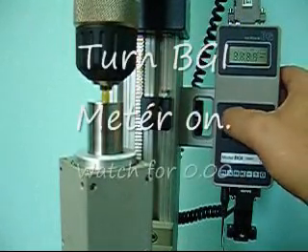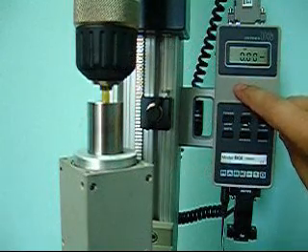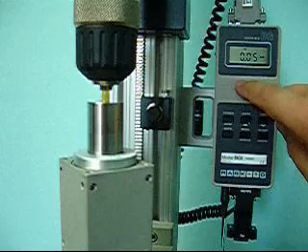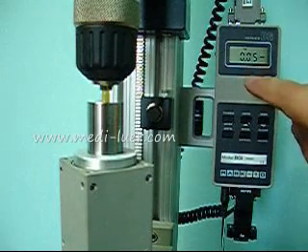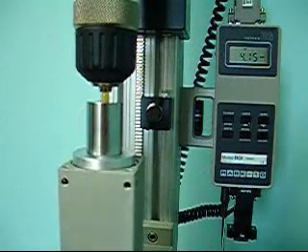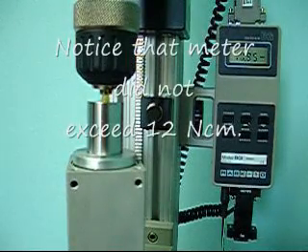I will turn the meter on. The meter comes on and it zeroes out. I have already set the set point to the equivalent of 0.12 newton meters of torque — in this case, as we know, that is 12 newton centimeters. Off screen, where you can't see, I push the counterclockwise button and it turns. The meter is counting up: 4, 10 — and it stops.